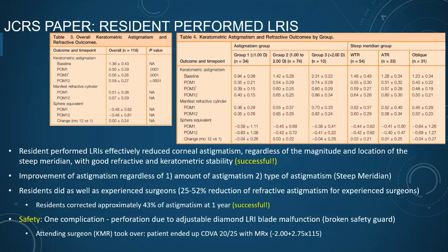In the interest of fairness, I should say, safety-wise, there was one complication. There was a perforation that we found due to an adjustable diamond LRI blade where the safety guard had broken, and I ended up having to take over that case and suture it closed.